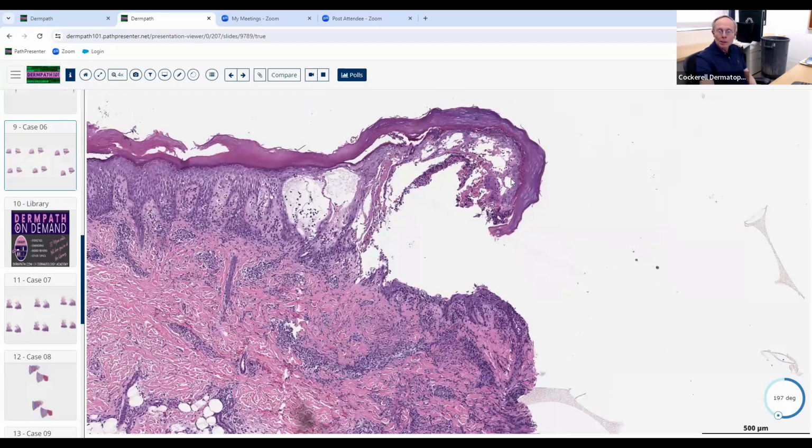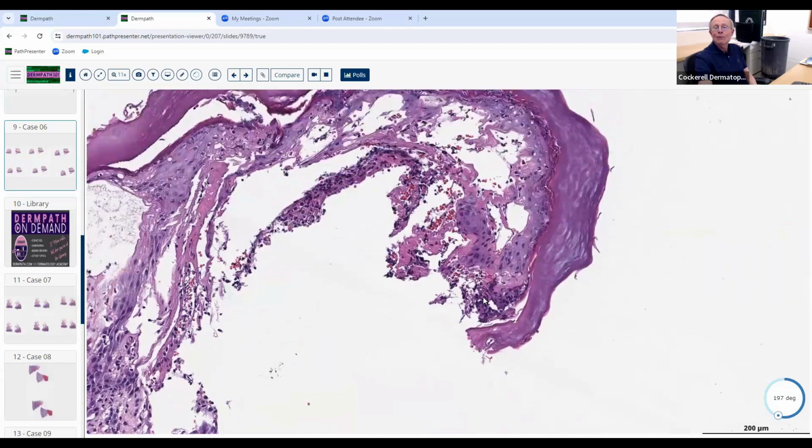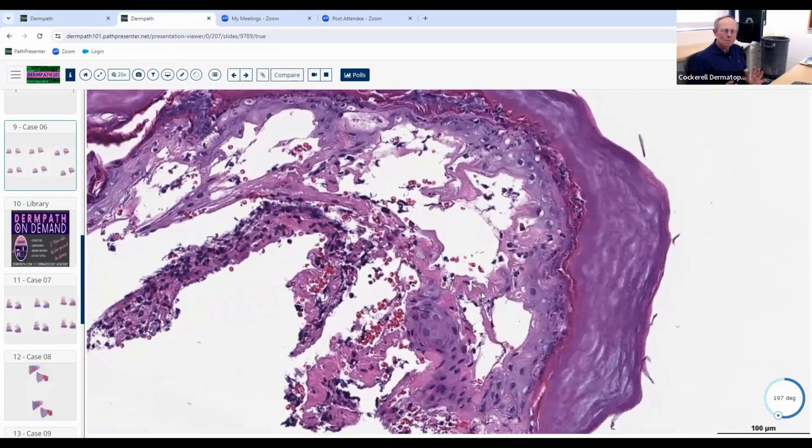But with the ballooning degeneration, one of the other things that can cause this is photodermatitis. Things like Hydroa Vacciniforme, juvenile springtime eruption. Those conditions will give you ballooning degeneration in the epidermis. And that's actually what this is in this case, interesting enough. This is Hydroa Vacciniforme. Now, this is a little bit too hard. They wouldn't show you this and expect you just to make this diagnosis, at random. If I saw this without any history, I couldn't make it at random either.